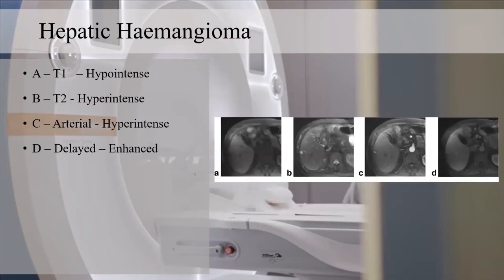Moving to the next, hepatic hemangioma. Here we have four images: T1, T2, arterial, and delayed phase. Hepatic hemangiomas are hypointense relative to the liver parenchyma. So in T1, they are hypointense relative to the liver parenchyma. Here the lesion is very hypo compared with the liver parenchyma, and in T2 it will be hyperintense relative to the liver parenchyma. It will be hyperintense, but the intensity won't be that hyper like the fluid or the CSF. It will be less hyper compared with the CSF.